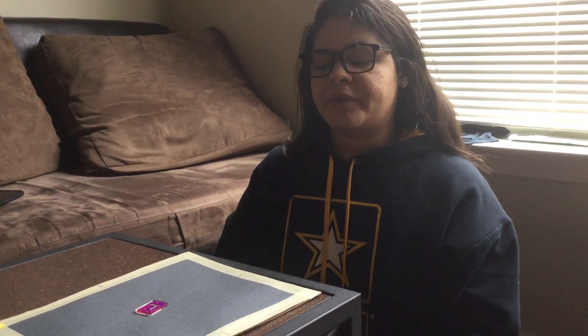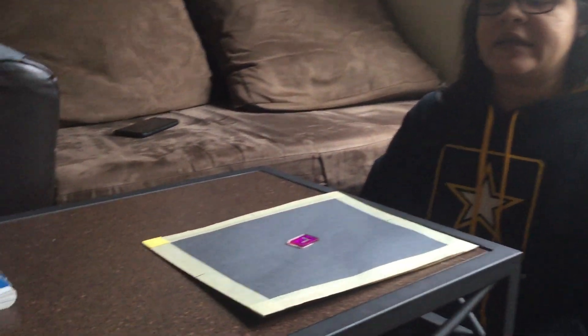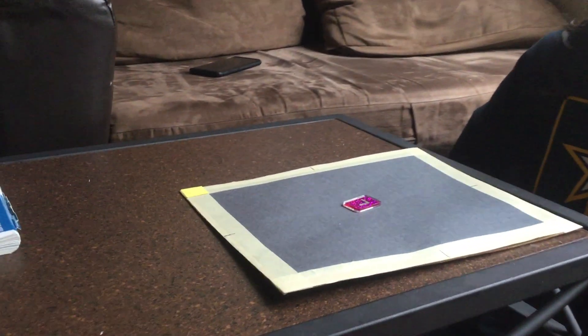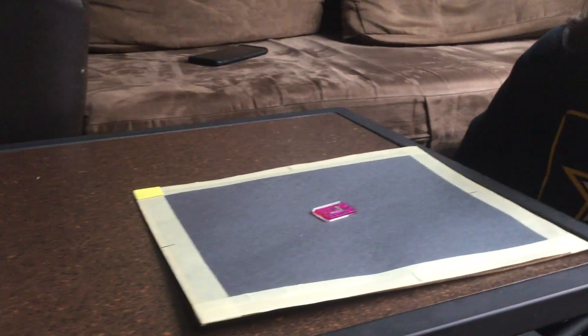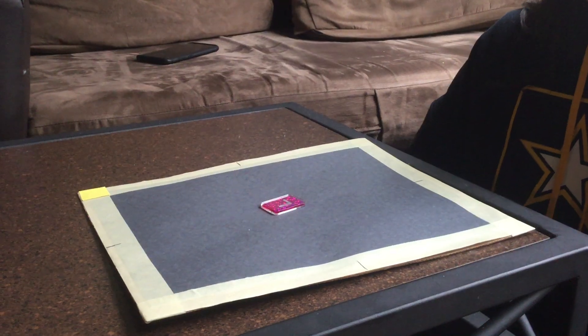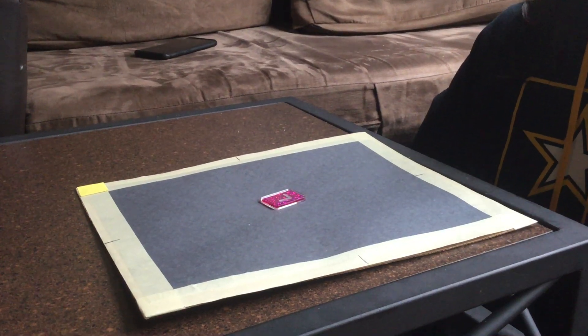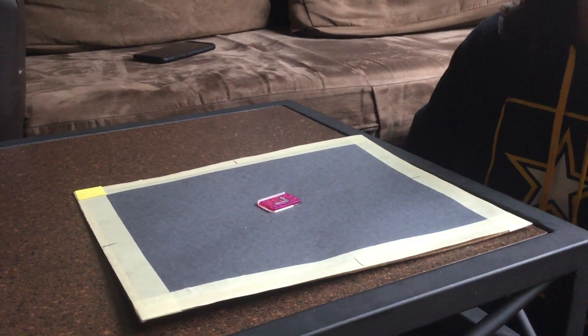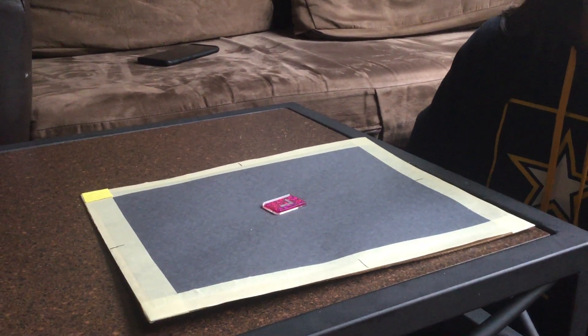Good morning, my name is Rosa Hora de Jesus, and I'm going to be giving some examples of thumb positioning for x-rays. We're going to be using a 10x12 cassette, and the SID is going to be at 40 for all of these images. I'm going to be using my left hand.